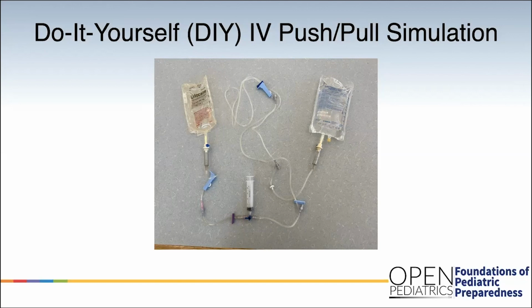In summary, the push-pull method is a great way of IV fluid delivery in a pediatric patient with shock, especially sepsis. The method has a benefit of being able to be performed by a single provider, allowing for rapid administration of IV fluid, and allows for exact known small volumes of IV fluid to be delivered.